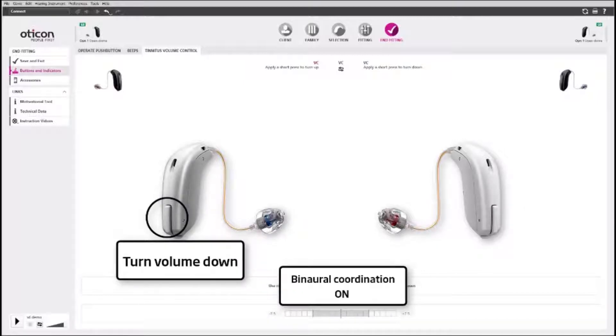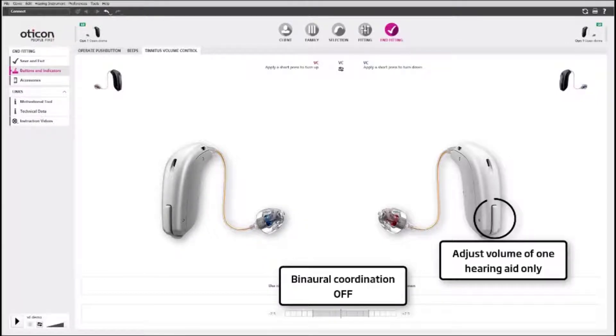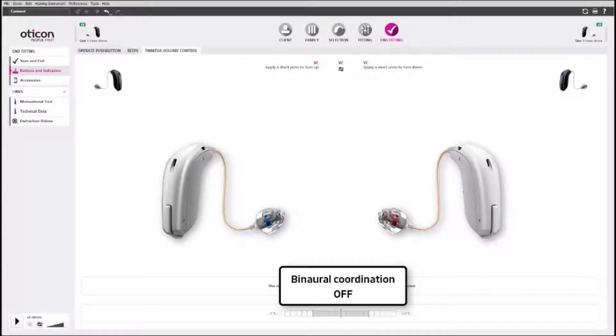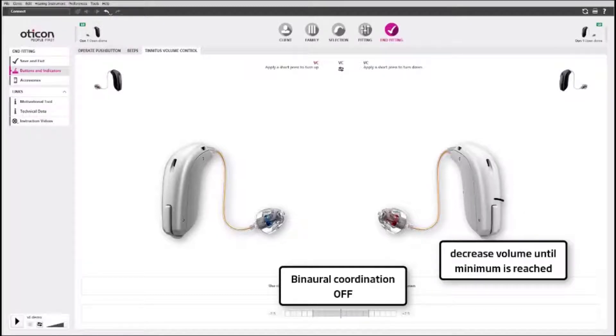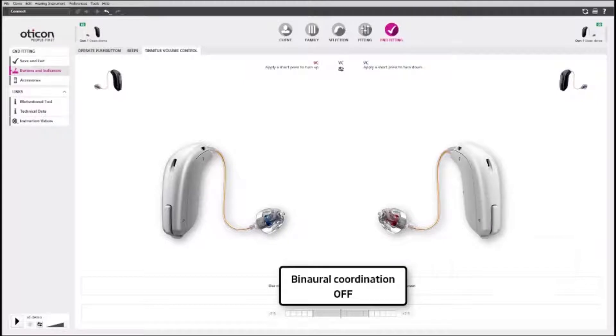With binaural coordination turned off, pressing the push button on one hearing aid adjusts the relief sound volume for that hearing aid only. Each time you press the button, you increase the volume until the maximum volume is reached. After that, each press decreases the volume until the bottom of the range is reached. The cycle then repeats itself.